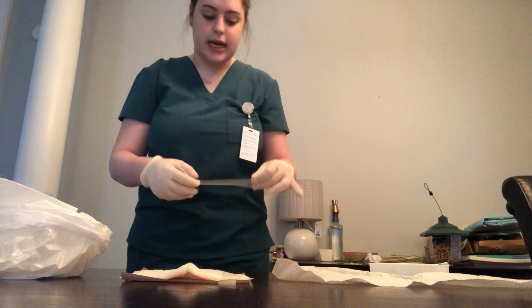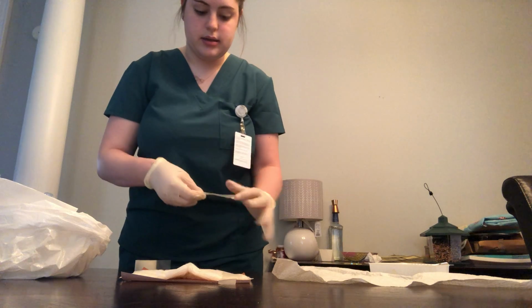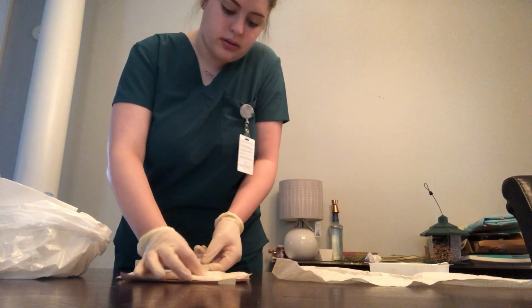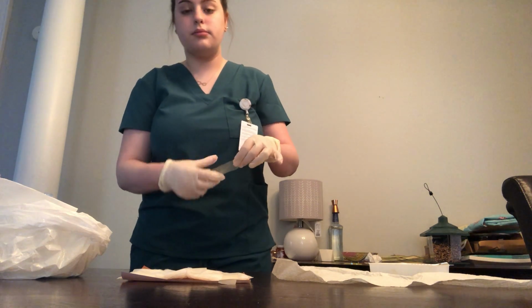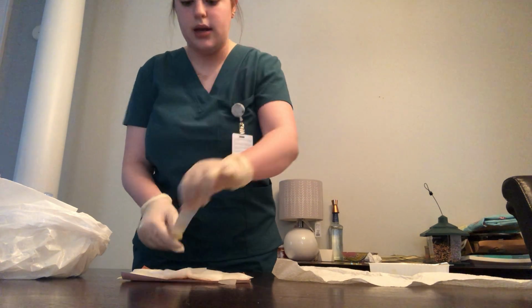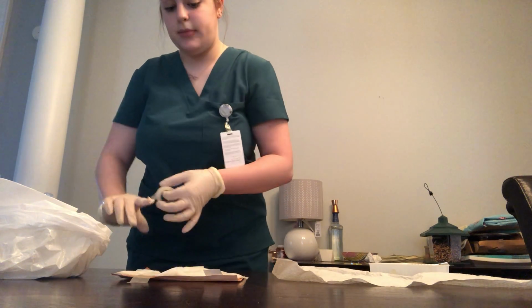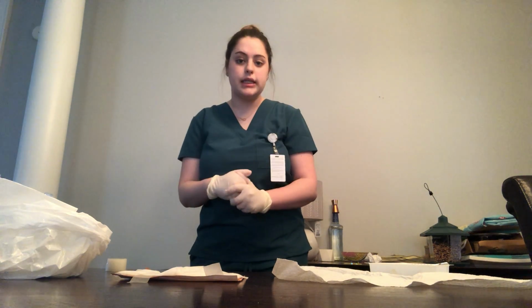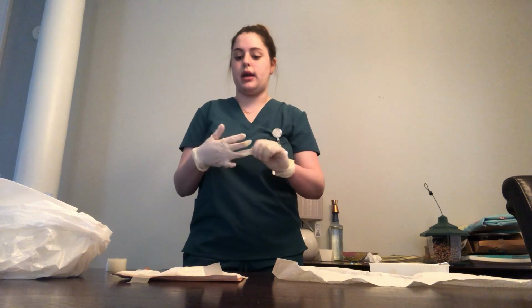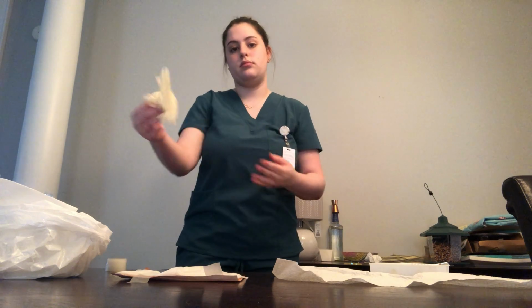And you're just going to properly tape it all. You want it to be properly secured so that nothing's falling out. And one last, I'm doing 3 to hold it, which is probably the best for it. Okay. And just like that, my wound is now covered and cleaned, and it is looking good. So I can get rid of these. Okay, so that is properly secured.